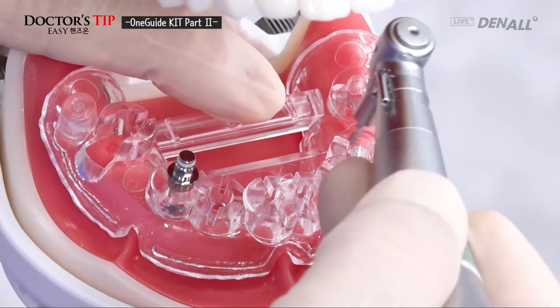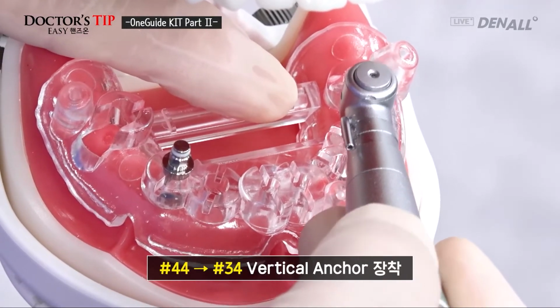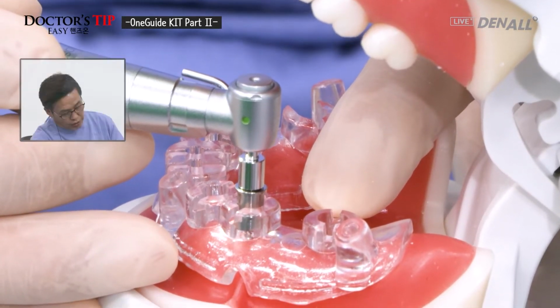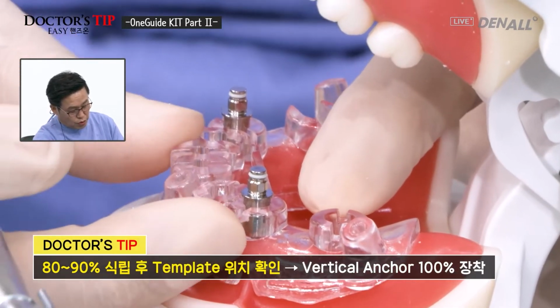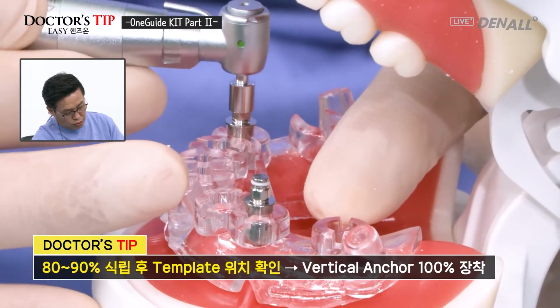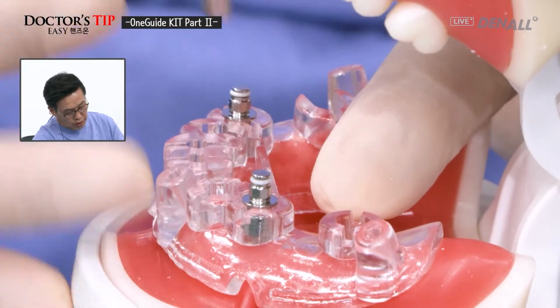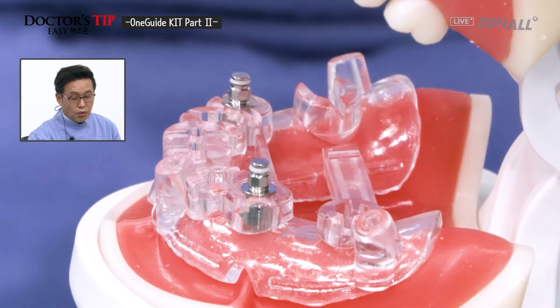I'm going to change to drilling mode on number 34. Drill hole is made and vertical anchor is placed on number 34. So once these 2 are 80-90% in, check the template position and then mount it fully. Do it in turn so that it is fully mounted, so that there's no movement. Vertical anchor is mounted fully on both sides.